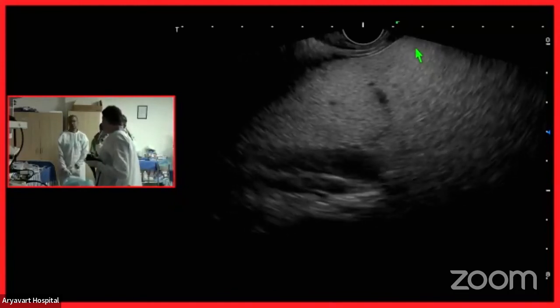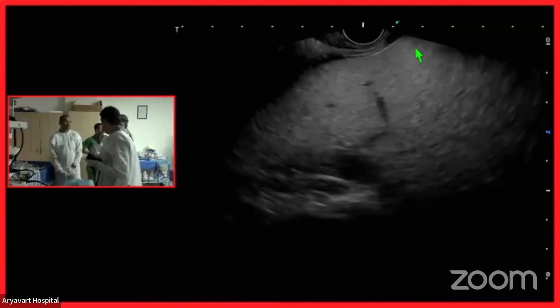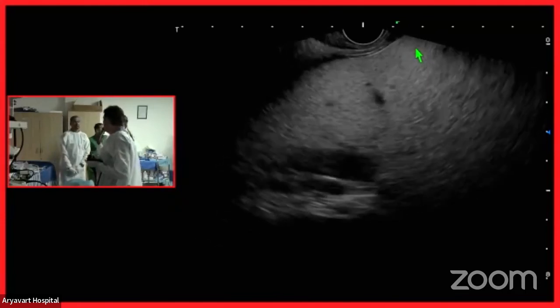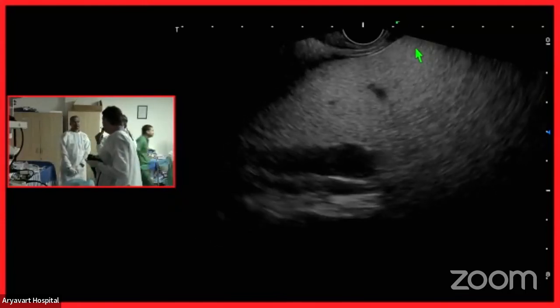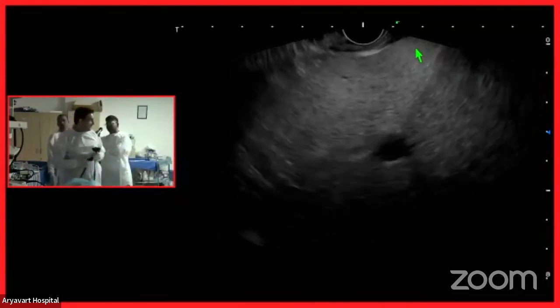I think better is to observe. Initially choose a very avascular area, just like a normal FNA procedure. Small bleeds can be managed. Try avoiding puncturing an artery because that is the most common cause of complication, leading to bleeding as well as fistula.